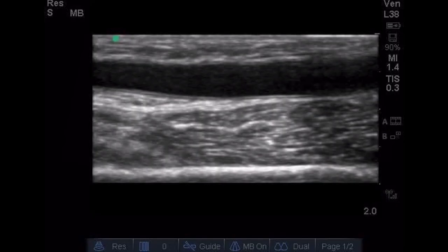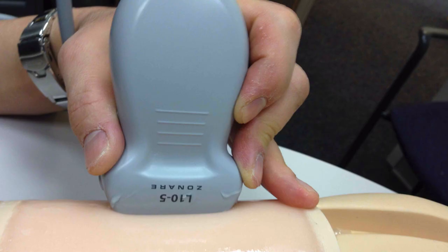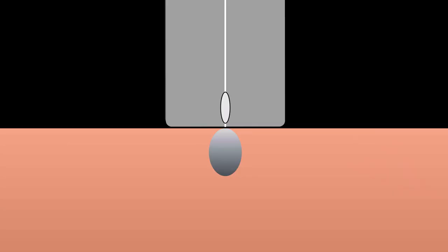What you want to visualize in the sagittal plane is a long vessel extending across your field of view with bright walls — that means you're in the center of the vessel with an excellent view for cannulation. Use a very low grip on the linear array probe, more like a pencil than a knife, for fine motor control. Extend a finger to stabilize the probe against the patient and prevent sliding. Note the seam in the middle of the probe casing — this helps you align your needle with the ultrasound beam.